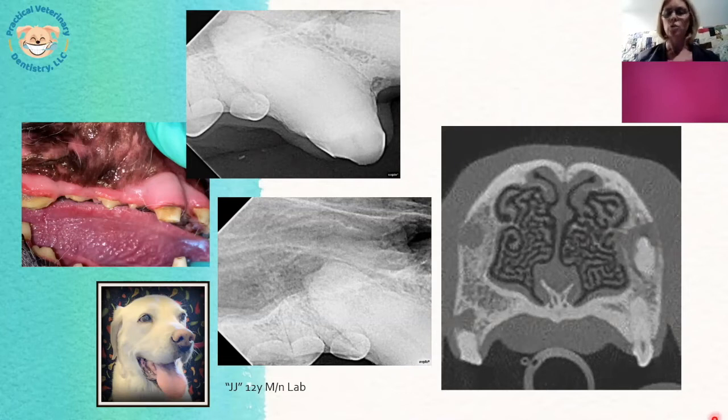It's possible that you could consider doing root canal therapy on it, but this would be one of those situations where if you choose to do that, you have to be prepared that any of your cleaning agents that you're using to work on the root canal could leak out and could potentially leak out into the sinuses. So, you know, those of us that have done root canals have all heard or read about situations where bleach ends up in the nose, or if you read about doing root canal therapy in humans, there's always horrible pictures of bleach leaching out into the tissues.